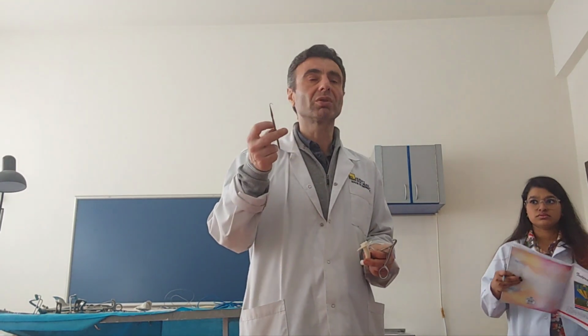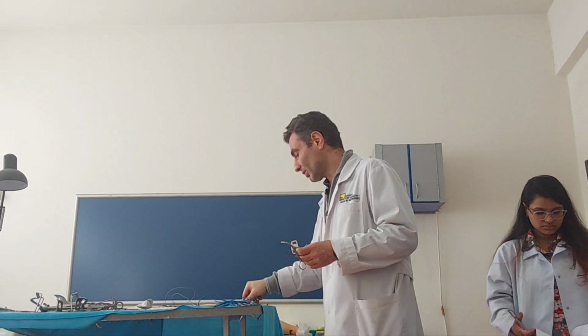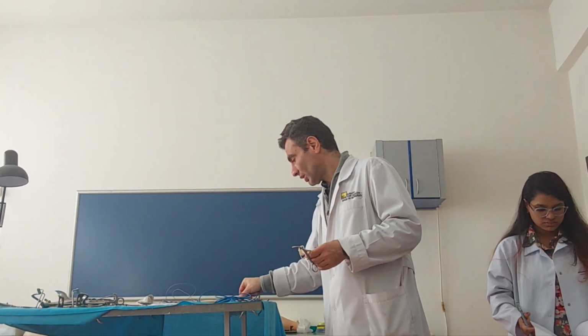Group number 4, the first instrument we call the single sharp hook. Using this hook, we fix the trachea and prevent any movement of it. Then I take the instrument from group number 1. It is a sharp-pointed scalpel, and I perforate the cartilages of the trachea, one or two, comparable with the size of the tube. Yeah? For adults, bigger, for children, smaller.